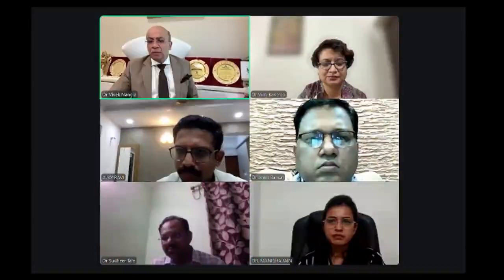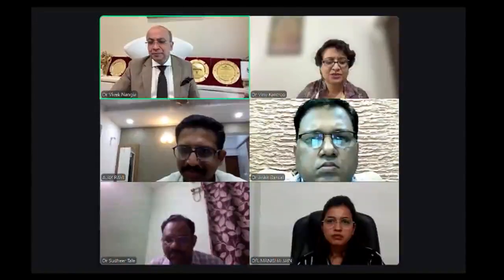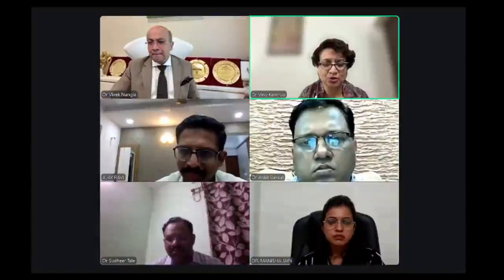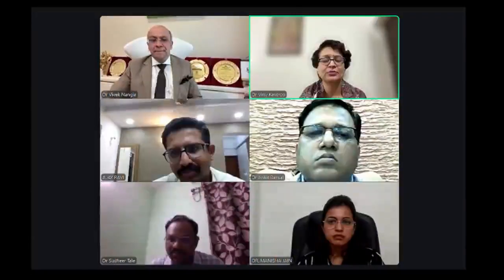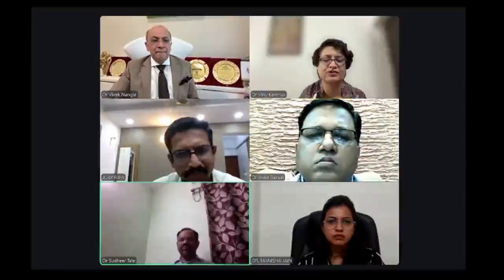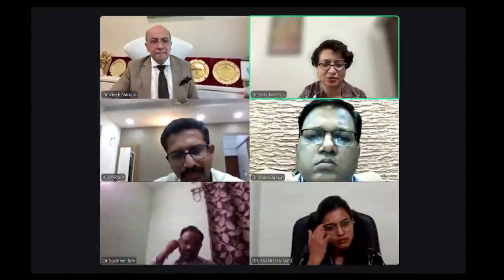Dr. Omkar from Jaipur would like to know what should be done in case of coughing mid-procedure. Dr. Vinny? So mid-procedure, if your patient is coughing, what we do is spray as you go. Once you give that local anesthetic spray, usually this kind of coughing subsides. However, if you're in a procedure where you're taking a biopsy, you can ask your anesthetist to give additional doses of propofol or fentanyl or midazolam, whatever anesthetic agent they might be using.